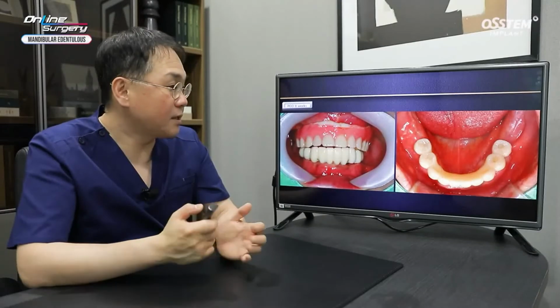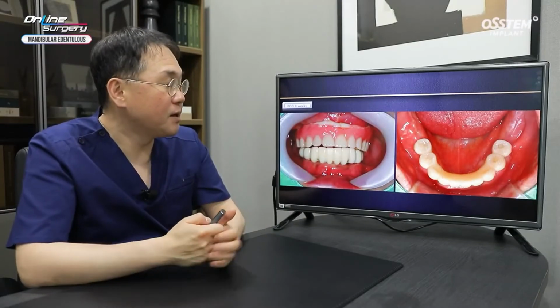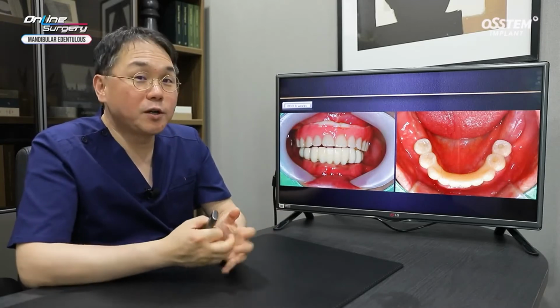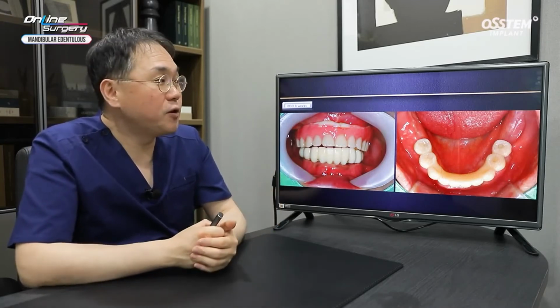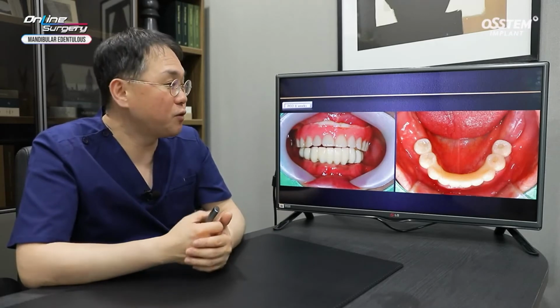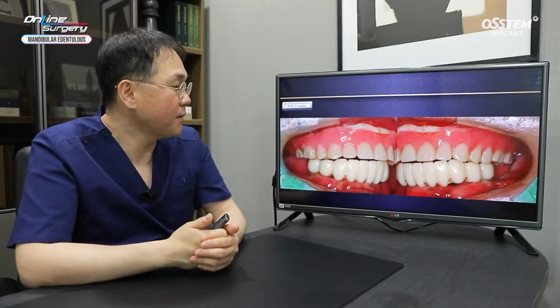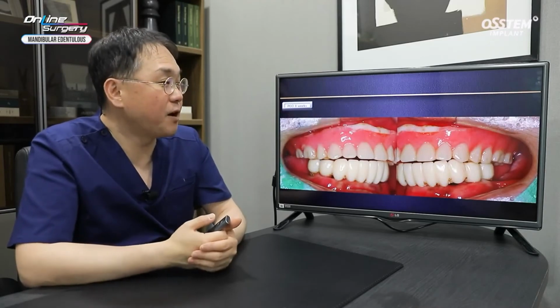At the 8th week follow-up, overall cleaning was done. Healing abutment was not connected on the posterior area because primary stability was not good. Cover screw was connected in number 6 and 7 on both sides. The soft tissue healing is done nicely. This is the lateral view as shown.